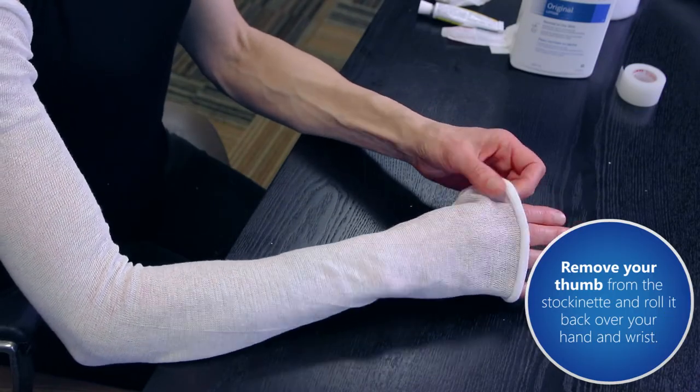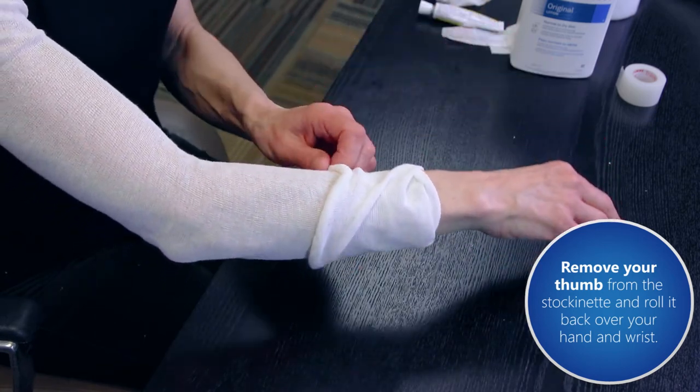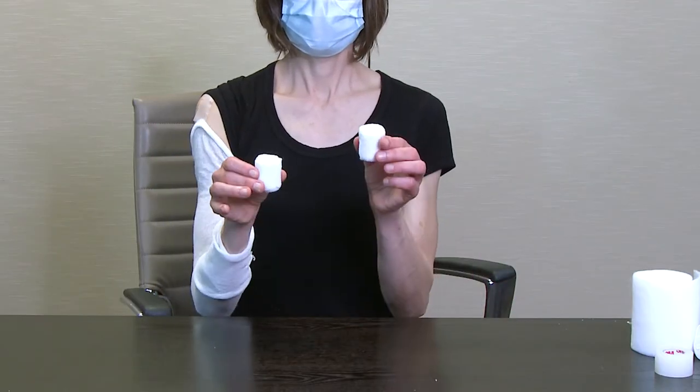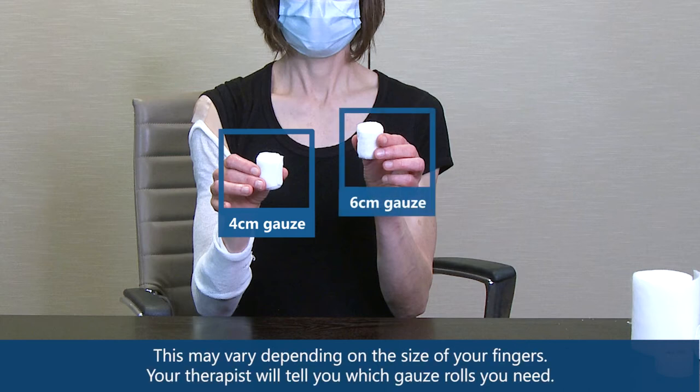Remove your thumb from the stockinette and roll it back over your hand and wrist to bandage your fingers and thumb. You are now ready to bandage your fingers. You will need two rolls of gauze. For most people, the first roll will be a 6 cm gauze roll and the second will be a 4 cm gauze roll, but this may vary depending on the size of your fingers. If you have small hands, you may use two 4 cm gauze rolls. Your therapist will tell you which gauze roll you need.